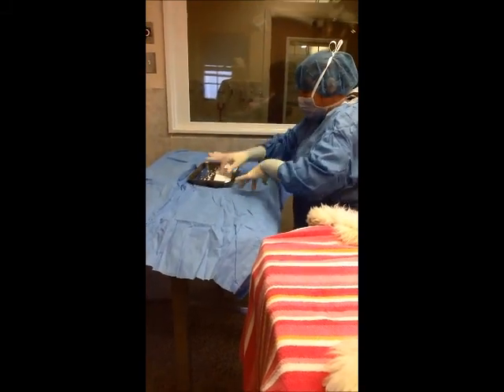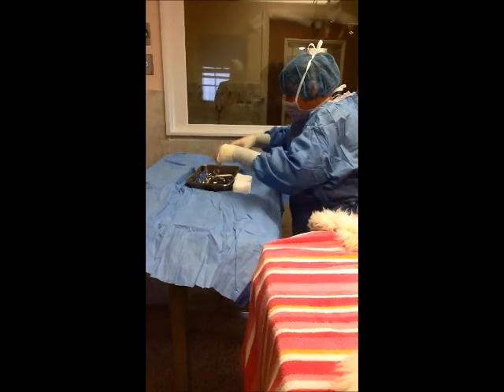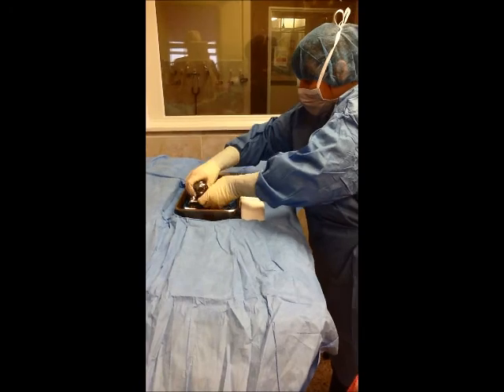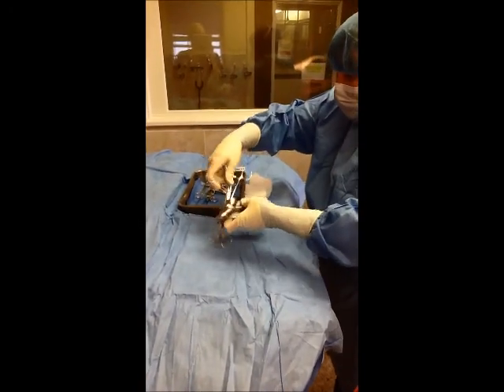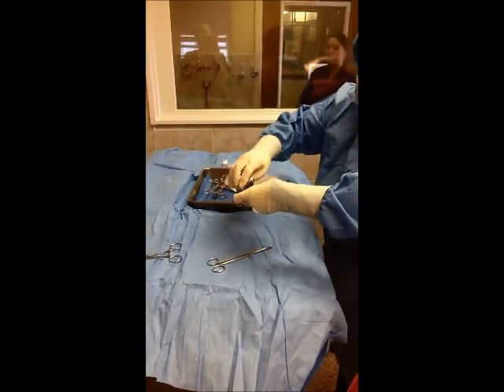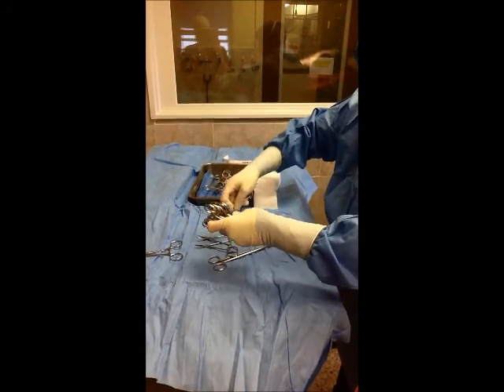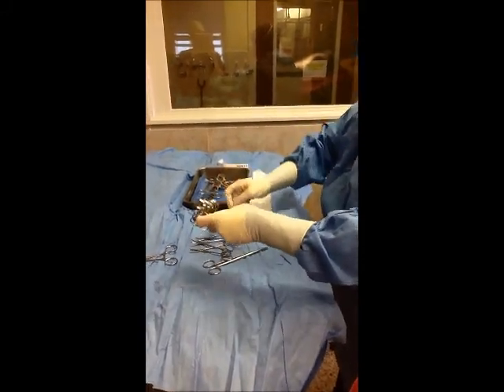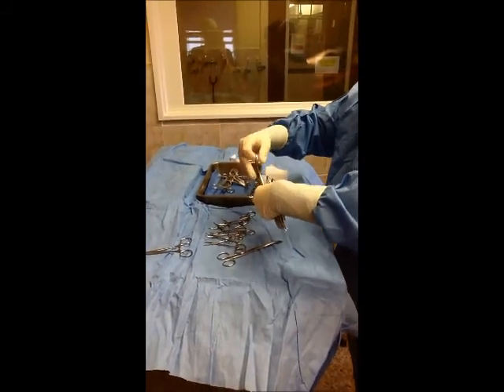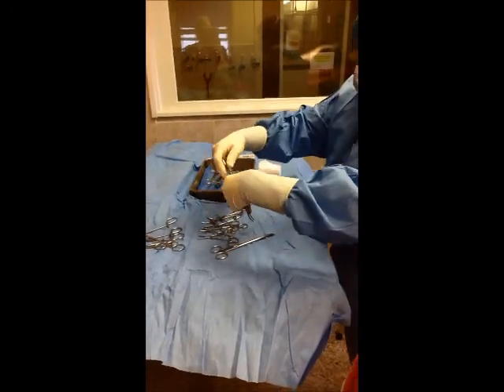Okay, so we're setting up for our spay. And our OK tag. He likes his larger hemostats in the back.